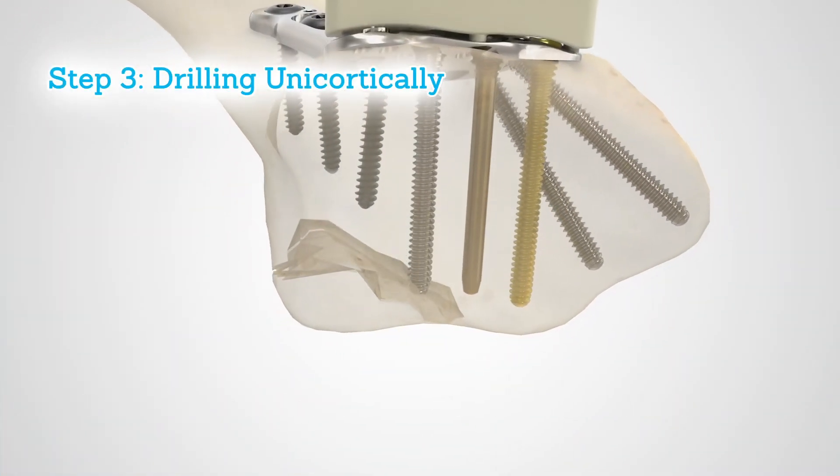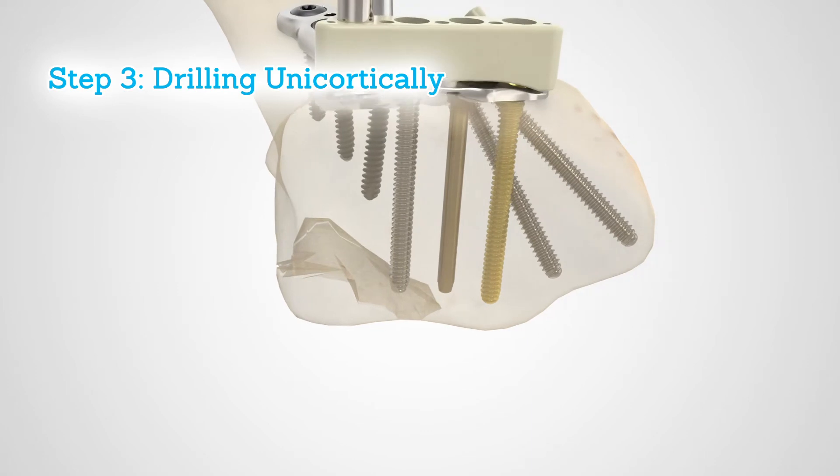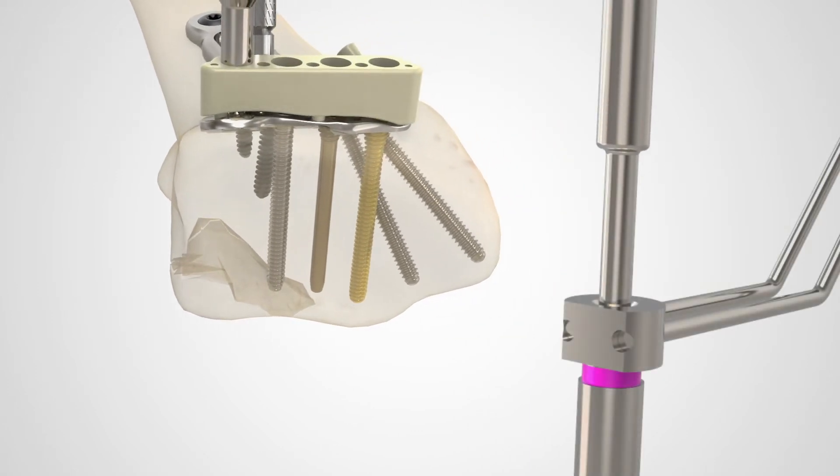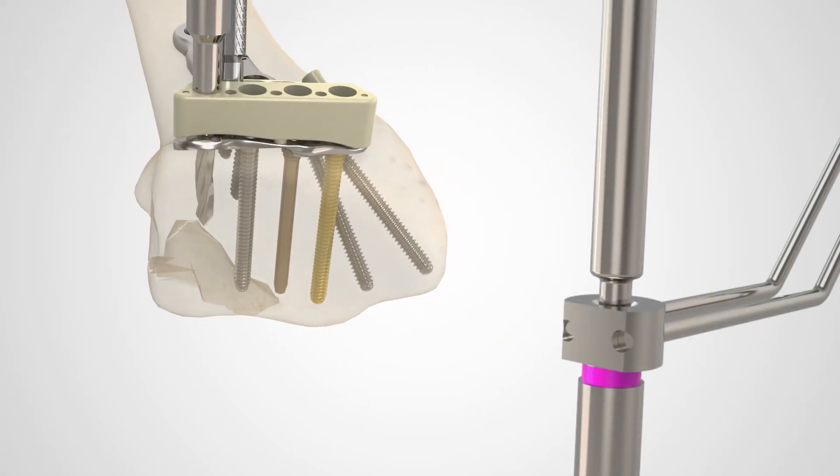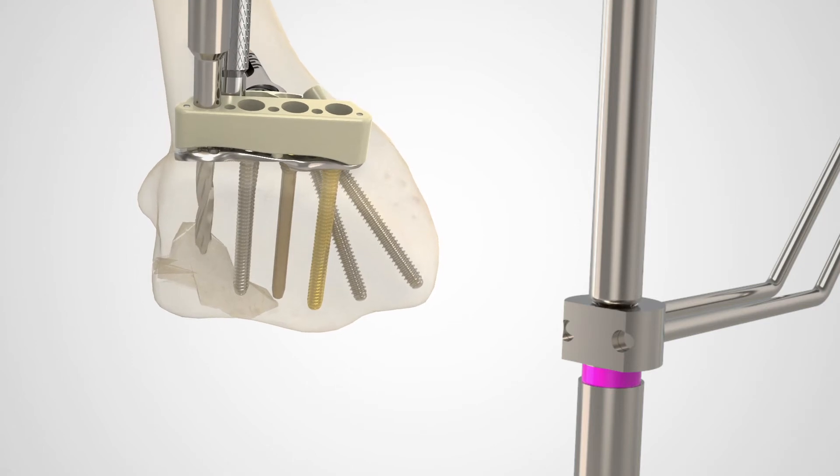Drill unicortically with the 2.5 millimeter FragLock drill. The shoulder of the drill must stop against the top of the FragLock 2.5 millimeter drill guide.